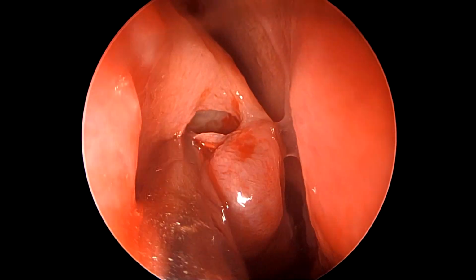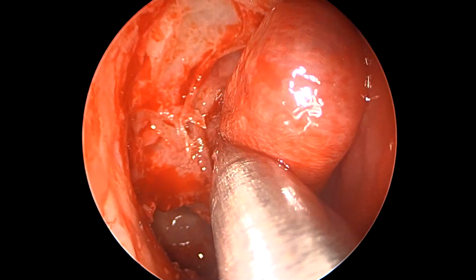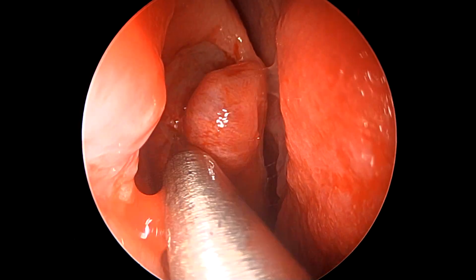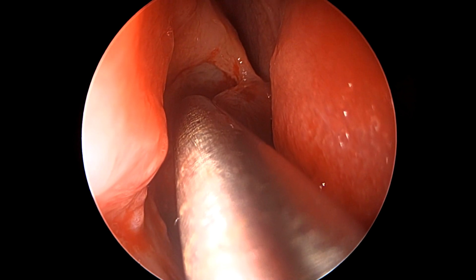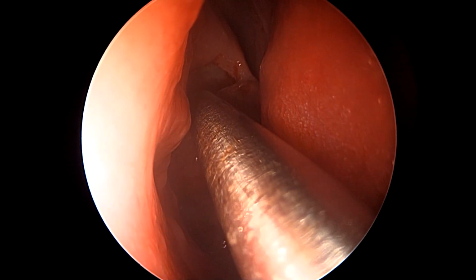It can be managed using simple bipolar forceps, but in such situations where we do not want a very big access, it is best avoidable. Here we are using a navigator probe to map our surgical landmarks from time to time, to show that there is no tracking error and we can corroborate what we see in front of us vis-a-vis what the navigation system is showing to us on the CT console.